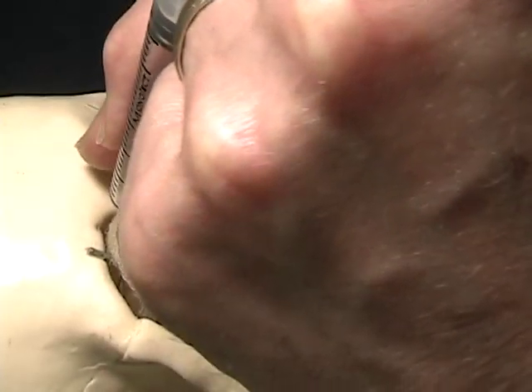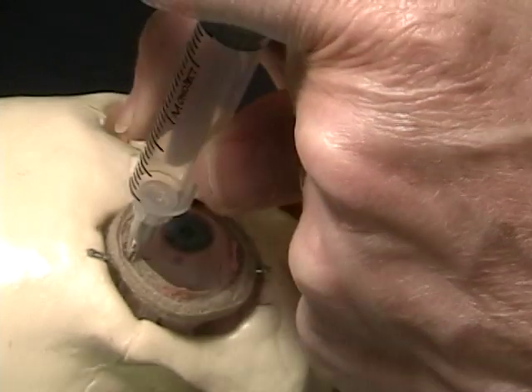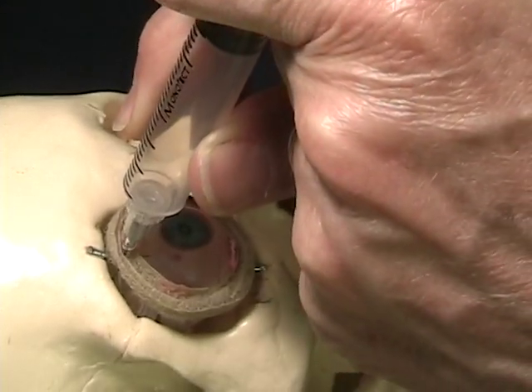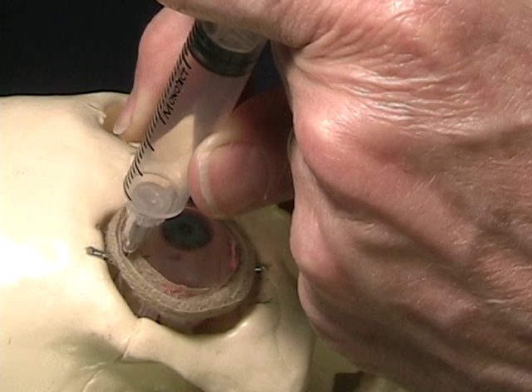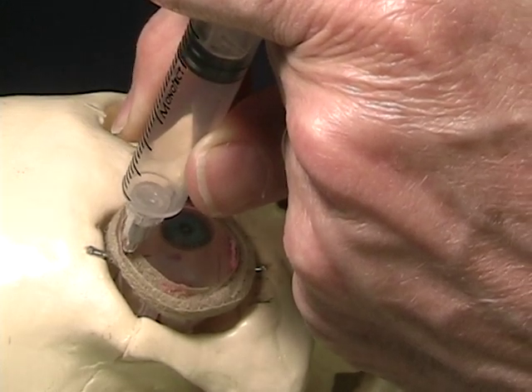Once we've reached 1 inch, we can secure the syringe, aspirate, and start again a slow injection of approximately 1 milliliter every 10 seconds.